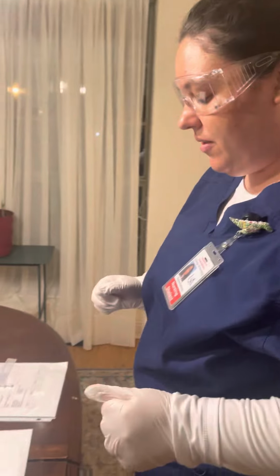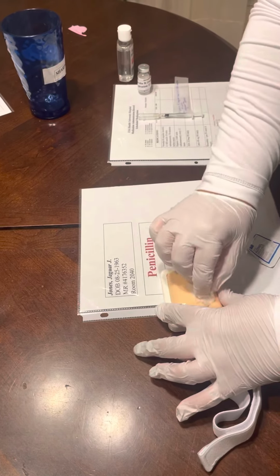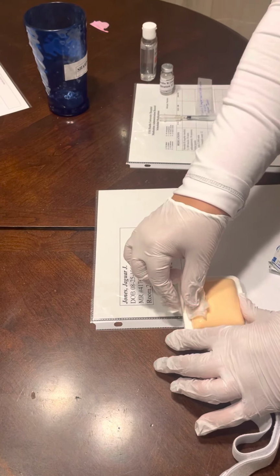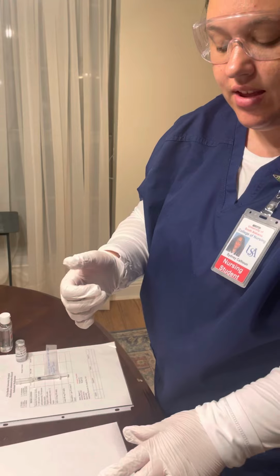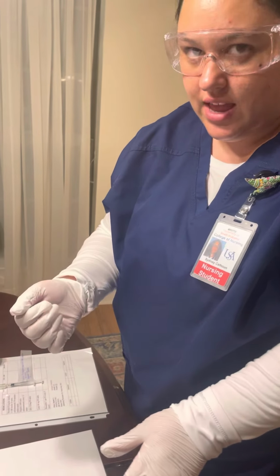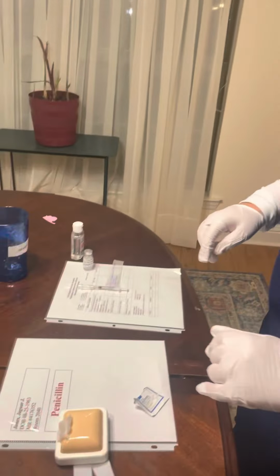I'm going to drop down the rail. I'm going to take my alcohol swab and clean. Put that right there. All right, if I can pinch 2 inches, I'm going to come in at a 90-degree angle. If I can only pinch 1, I'm going to come in at a 45-degree angle. And I'm making sure that there's no blood, no bruises or anything before I administer.